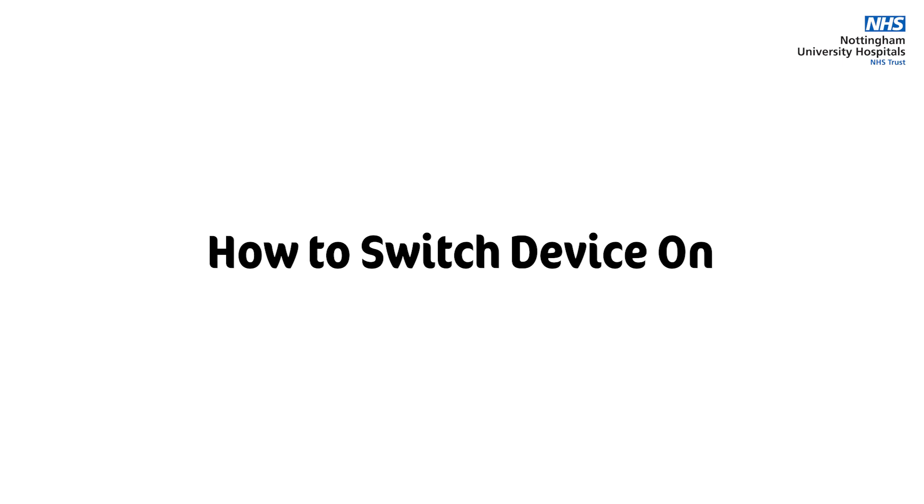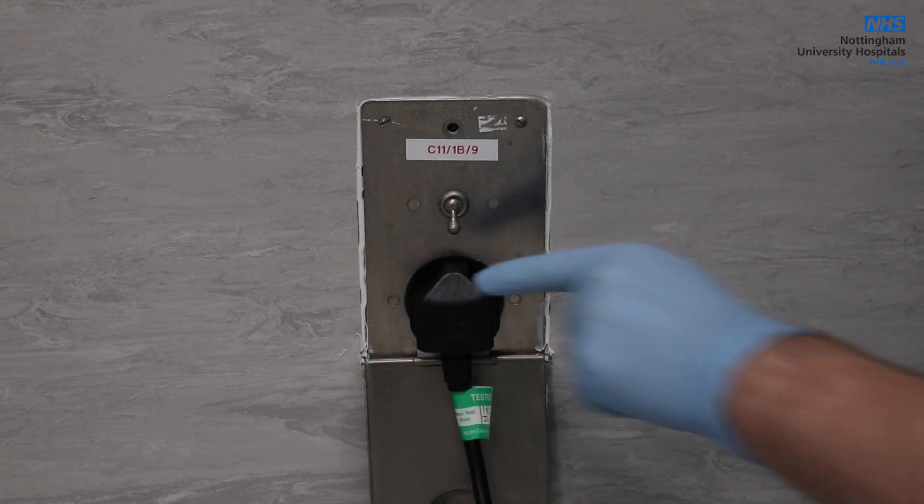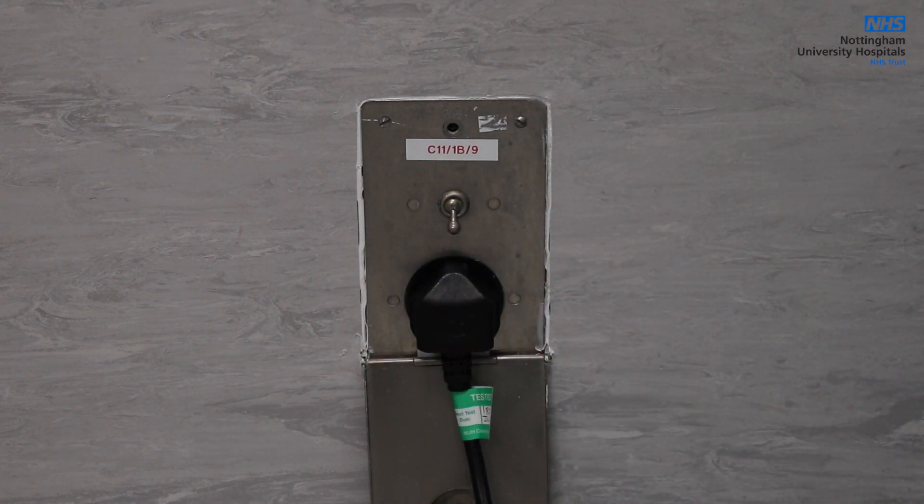To switch the device on, the device requires plugging into a socket with a protected earth wall socket and not an extension cable, as per manufacturing guidelines. If connected to an extension socket, there is significant risk of fire.